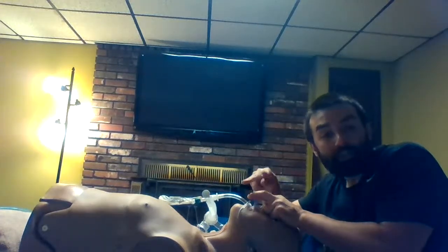So I usually grab a pair of hemostats or Kelly clamps, grab that thing, make sure when I cut it, I'm ready to thread this piece in, and then I use those Kellys to kind of help me slide this piece inside of the pilot line. This becomes your new pilot balloon. So this repair technique would work if you thought the problem was with your pilot balloon, or you thought you had a bite mark or something like that. Sometimes if I'm not sure, I'll give it a last-ditch effort and see if it resolves things.